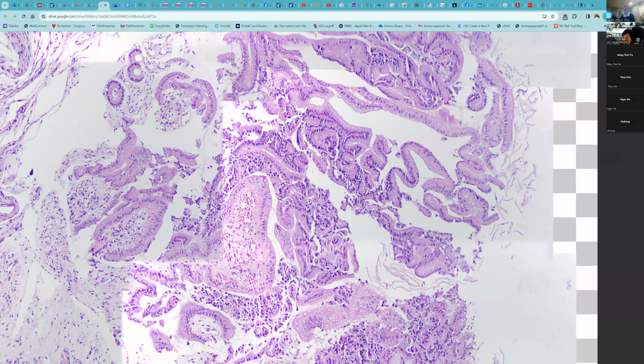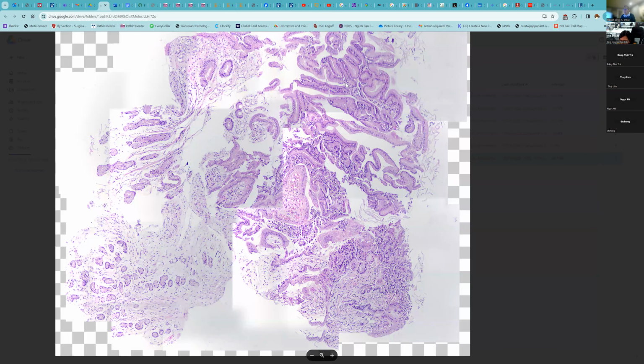So I think that this fits in the category of a hyperplastic polyp. We have a little bit of vascular proliferation here, which might indicate that there's sort of an inflammatory stromal proliferation associated with this. Sometimes the inflammatory polyps can have a very pronounced foveolar surface hyperplastic element as well. So the boundary between hyperplastic polyp and an inflammatory polyp is a little bit distorted.